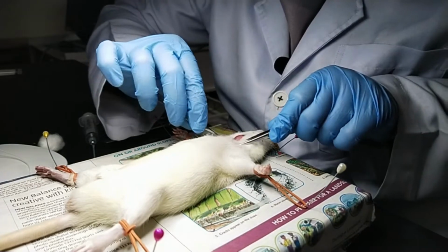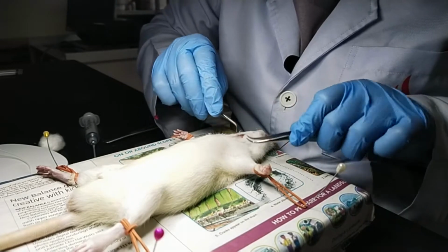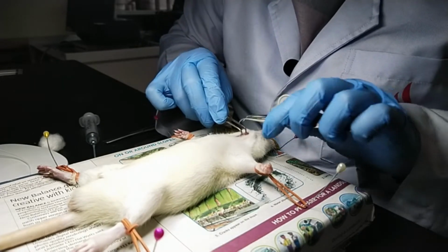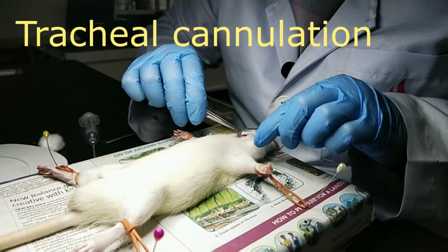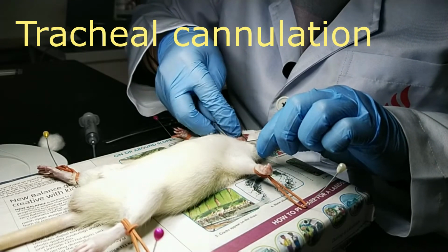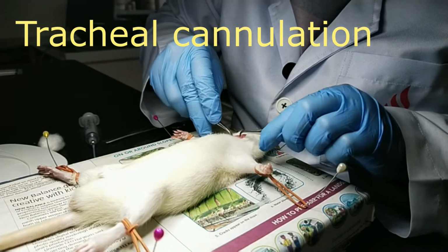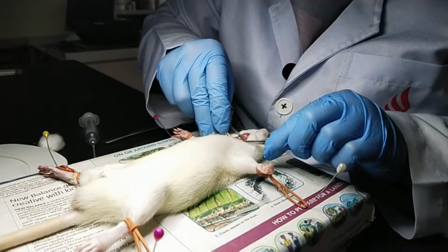Once it's open, you can stretch it out and try to locate the neck muscle. The reason we need to do tracheal cannulation is because we want to ease the respiration of the rat.